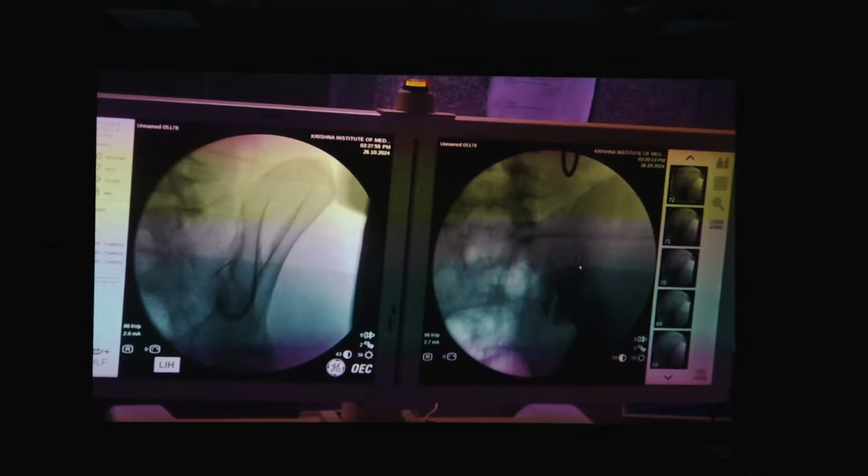I felt as though, like when you give a spinal, we feel a loss of resistance, a similar sort of loss of resistance I have felt. Another 5 degrees towards me. I'm just tilting the C-arm another 5 degrees to see whether it's in the intra-articular space.